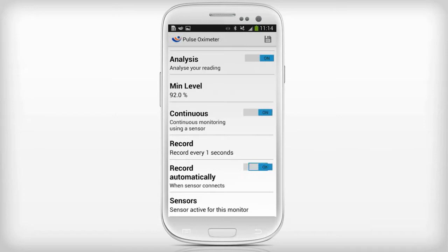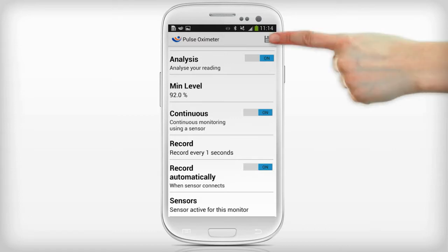Set record automatically to on if you want to record automatically when the sensor connects to MyFitness Companion. Tap on the save icon to store your monitor configuration.